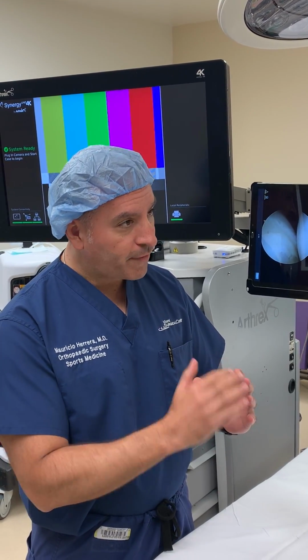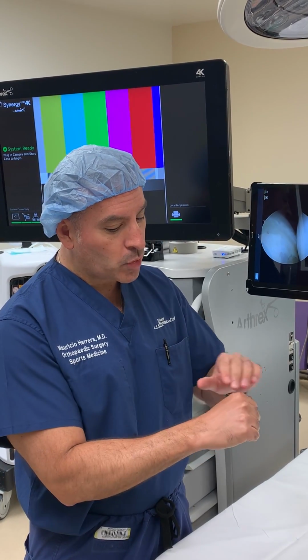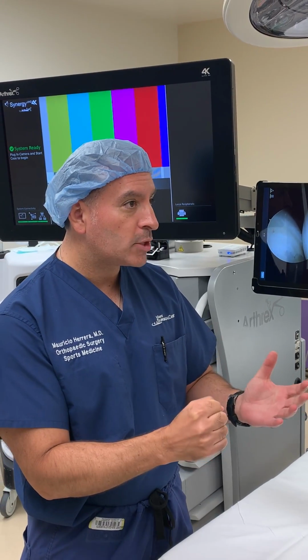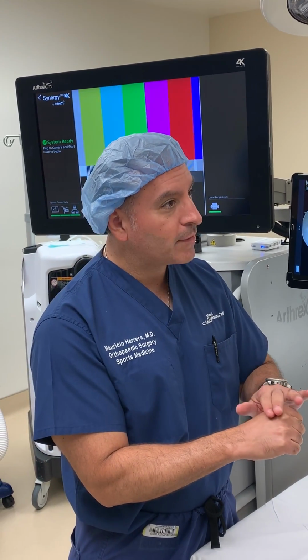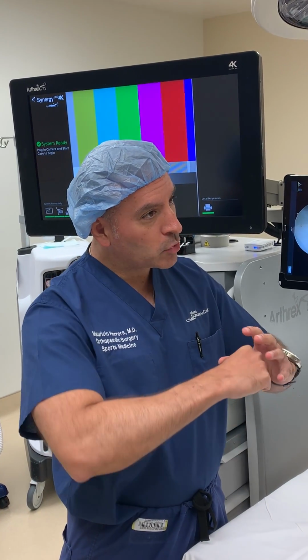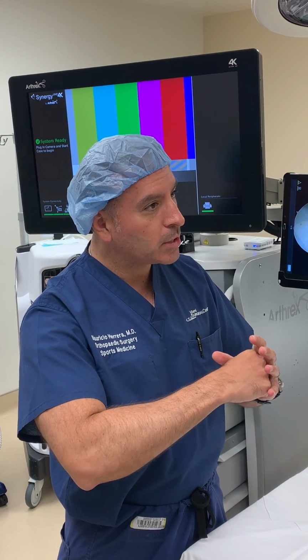And once we fix the labrum, we'll generally have to address a bump or an extra piece of bone on the ball side. We call this impingement, and it allows us to go in and shave down the bone and make it nice and smooth. This way, when you go to flex your hip, the bone is not hitting the cartilage anymore.